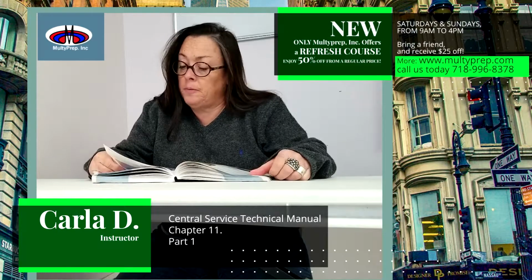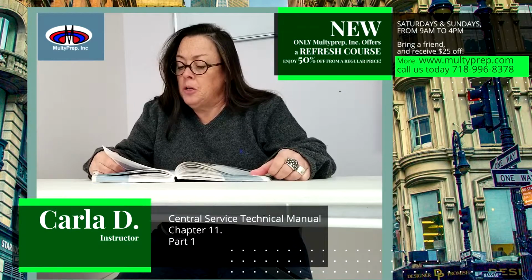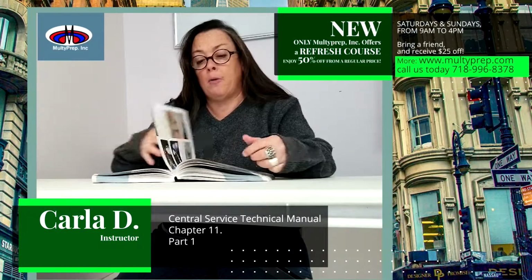CS technicians must be certain to follow the manufacturer's instructions and test instruments using the appropriate gas. Extreme care is required because testing instruments at an improper pressure can injure the operator and/or severely damage the instruments. See figures 11.11 and 11.12, which provide examples of air-powered instruments.